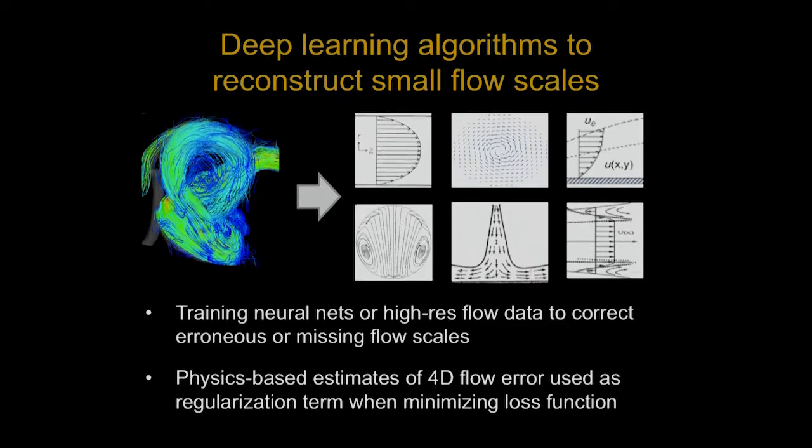And so by training our neural net on those classic simple flow solutions, we would be able to improve our velocity vectors in each subvolume. And then we can combine the subvolumes to form the complex flow in the aneurysm. So with that, I now give the microphone to Hemant.